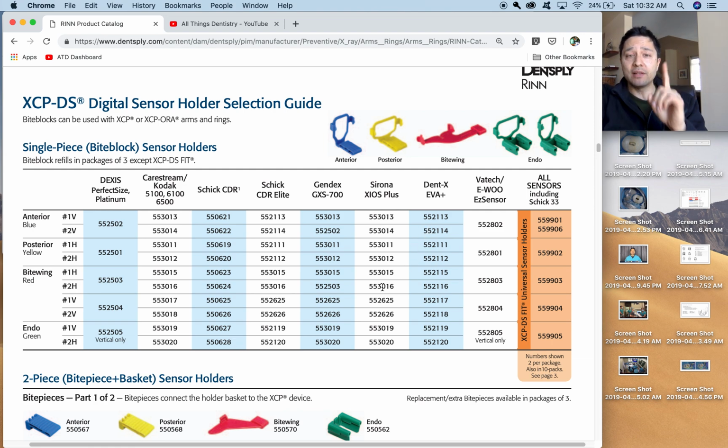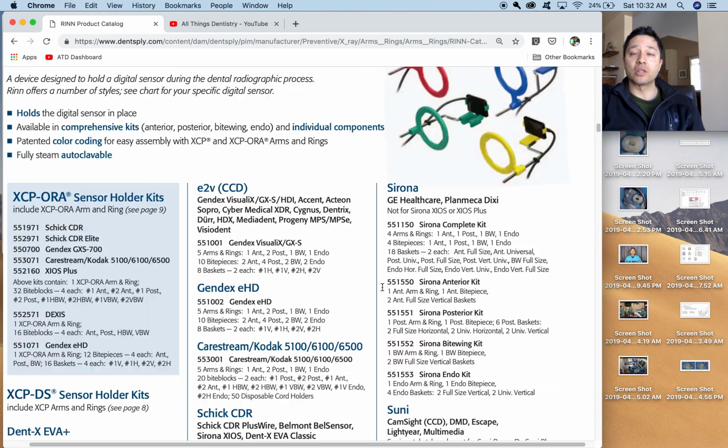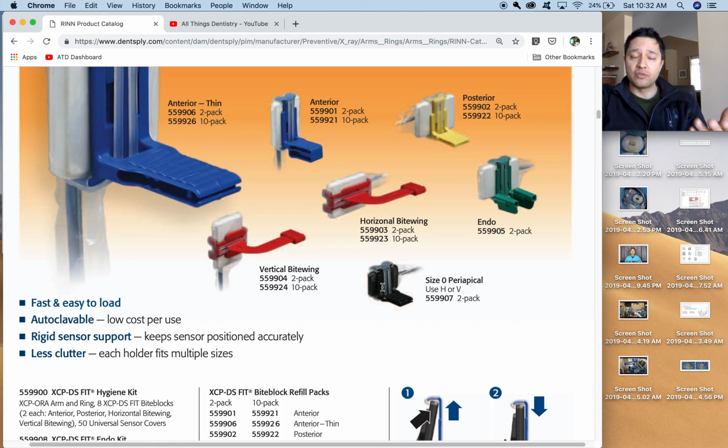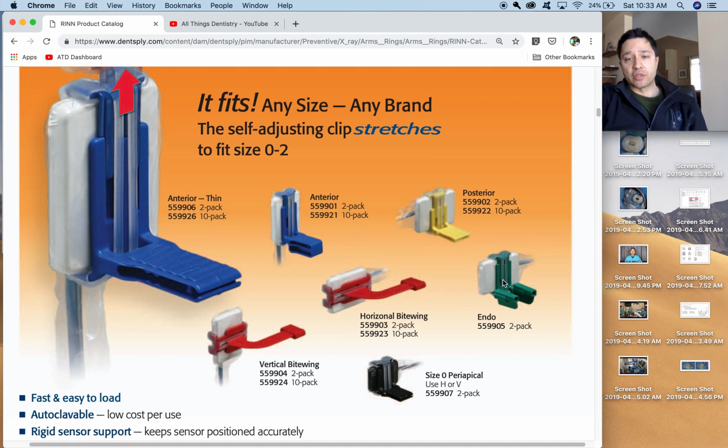However, when I was making this video, it was crazy. I couldn't believe it. I found something different, and I really appreciate this little exercise that I was asked to do because I found these elastic band ones. So this might actually change the game because now you can just place a sensor, and if you watch the video, there's a point where you have to finagle the wire into the little holder. This actually might be a lot easier because now it's just an elastic band.